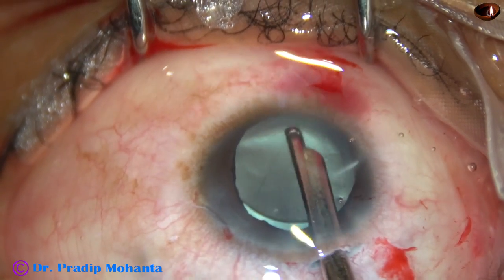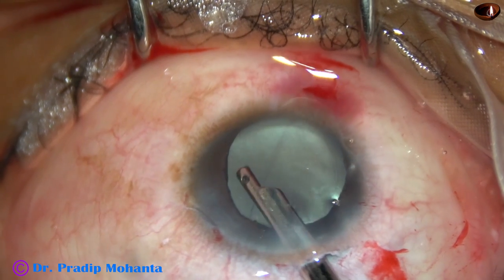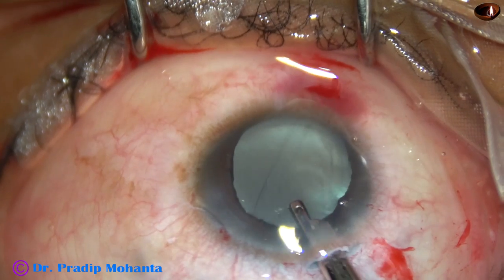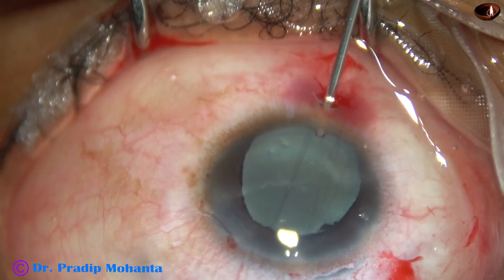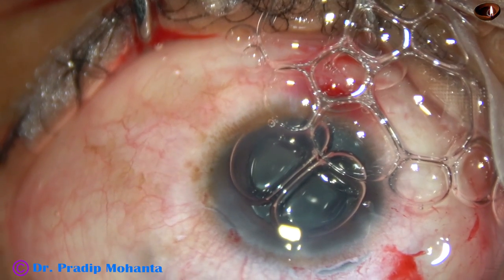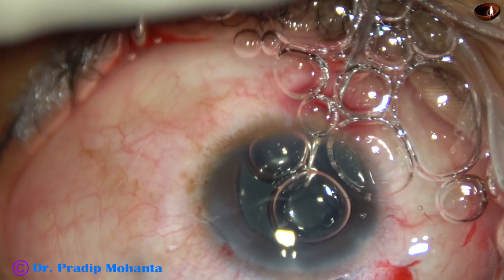This maneuver removes most of the visco from the capsular bag. The visco comes out through the main wound as I irrigate BSS. Again I irrigate some more fluid in the anterior chamber and then irrigate and aspirate for some time. Now I am injecting a little air and then a bit of pilocarpine to constrict the pupil.